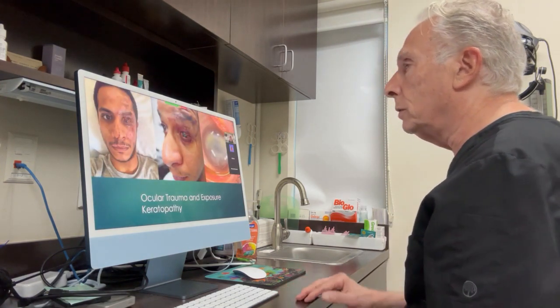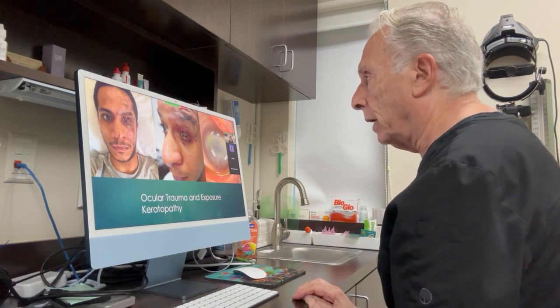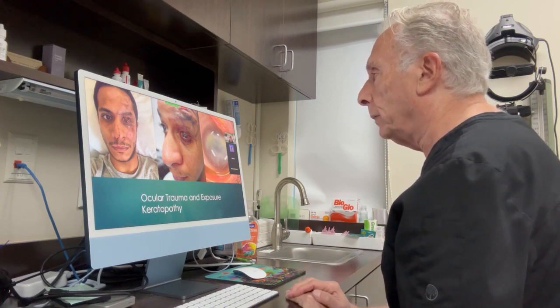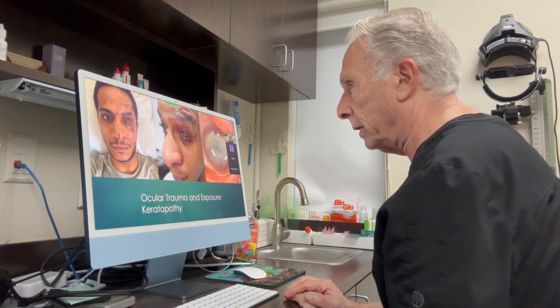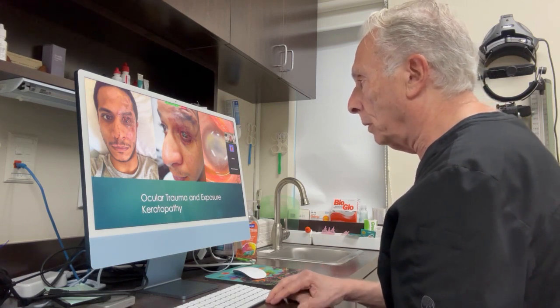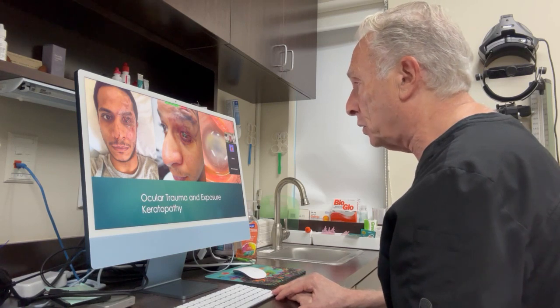Here's another patient who lost his upper left eyelid in a car accident. The lid was severed. I found this out later, but I was told that if we were unable to fit this patient with a scleral lens, they were going to remove his eye. But we fit the eye with a scleral lens. He kept the lens on almost 24/7. For 3 months, I saw this patient every day.